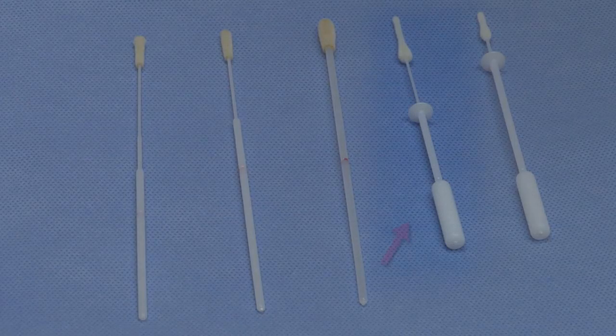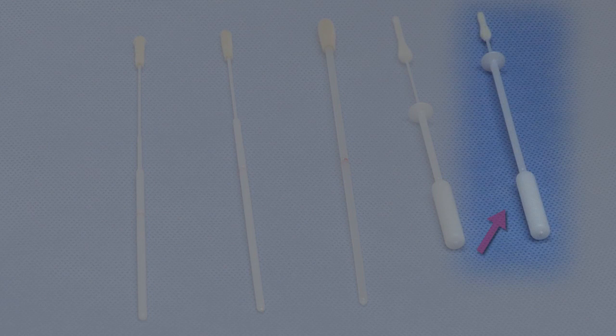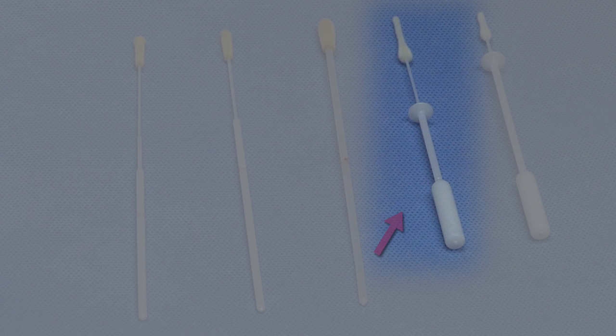This is the swab used to sample the mid-turbinate. It's a special swab available with a stopper on the shaft indicating the depth of sampling at the turbinates. The mid-turbinate swab guides the collector to the proper depth. There are two sizes of the mid-turbinate swab: one for neonates and infants up to three years old, and the larger one for patients age three and older.